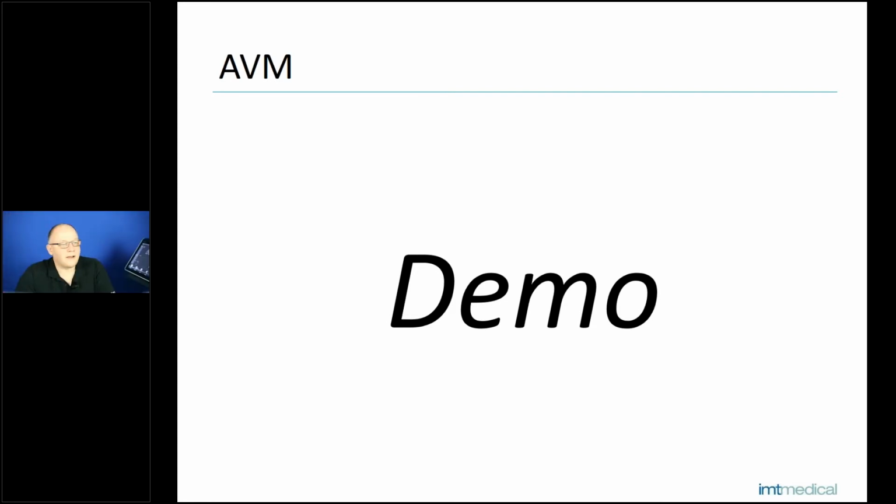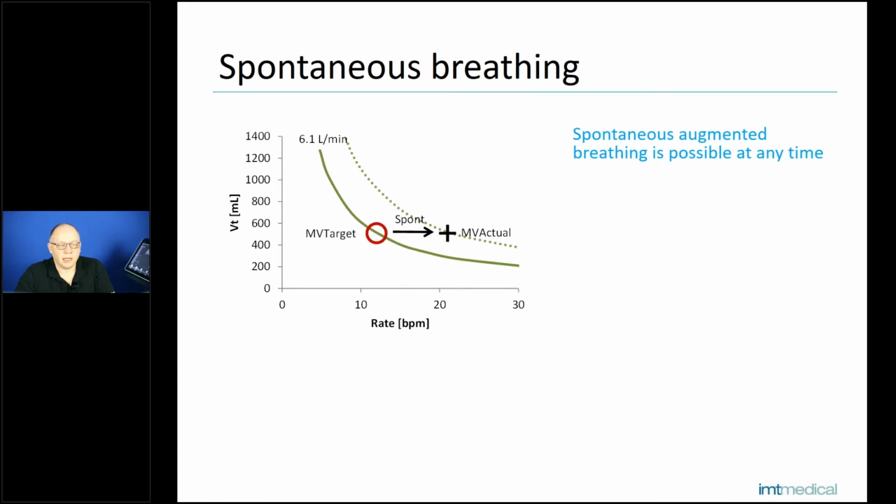If it's not a patient who will be extubated in the next few minutes, then you can adjust the minute volume, because maybe the patient's target is 7 liters, and the patient is breathing 10 liters. Don't reduce the target volume, increase the target volume and go near the current spontaneous minute volume. And then the patient will be more and more supported.